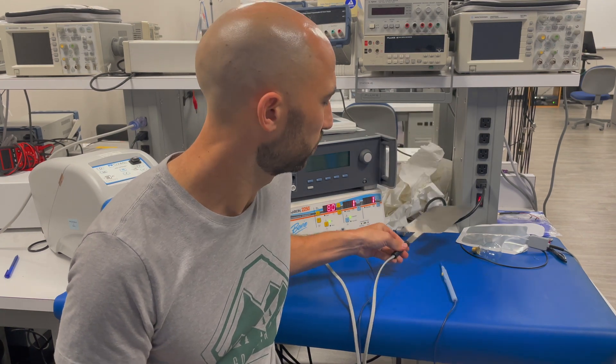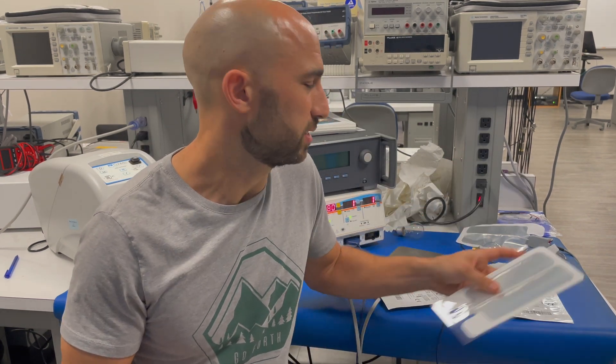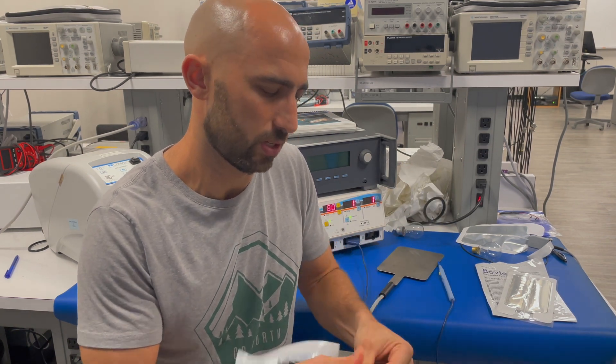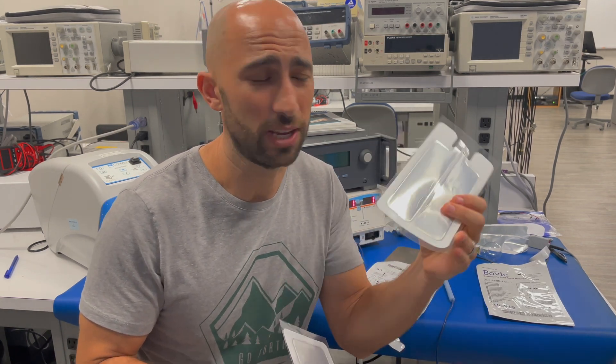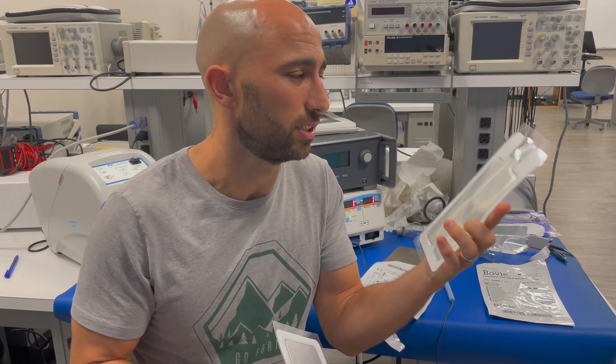Right here I have a solid return electrode and a split pad electrode. Earlier I showed you the plate electrode, which you usually don't see except in vet clinics. You can tell something about what your hospital cares about by seeing what type of electrodes they use. The split pad electrodes are always going to be safer, and I always recommend that hospitals work with split pad electrodes.